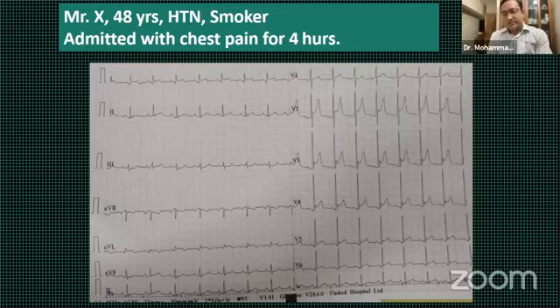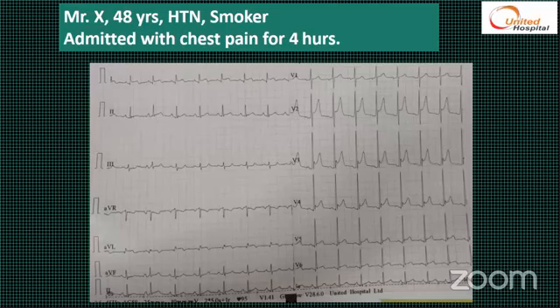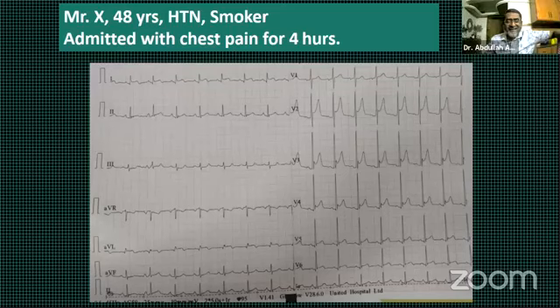Yeah, this is a tough one, and we could be here all day discussing the EKG, but let's do the differential. I tell the fellows that when you cannot make it out quickly, then go for a differential. Make sure that you're not missing anything. That's clinical medicine. So what are the most likely top 3 diagnoses? My rule is the differential is 3 or 5. After 5, you are looking for Harrison or Braunwald's. So what are the top 3?